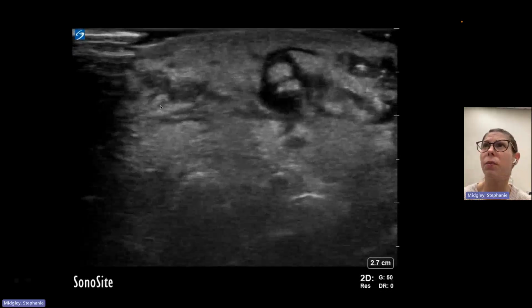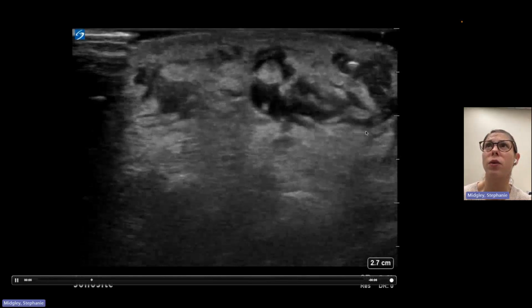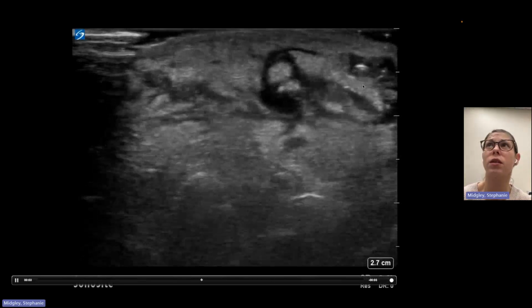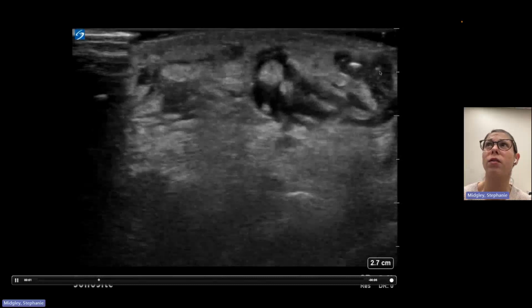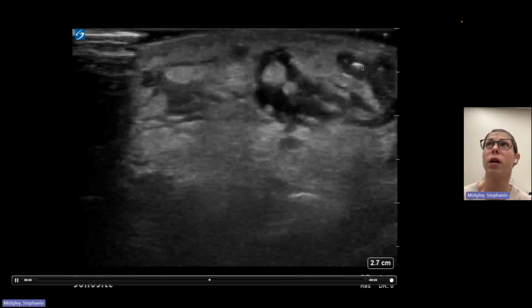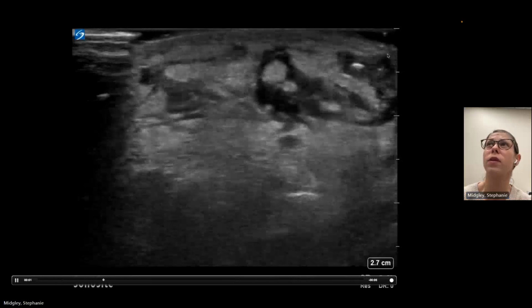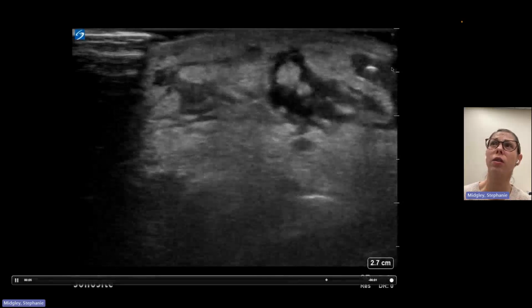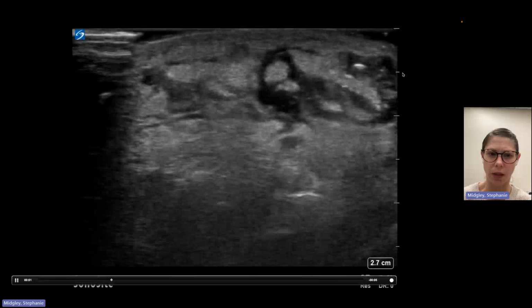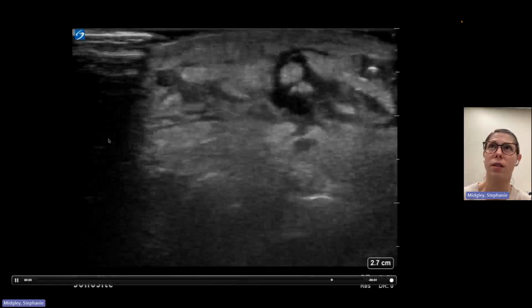Again, here's another example, also taken from image review. This was a patient also with an abscess on his foot. And when they were scanning, if your eye happens to pick up right there, we can see that bright white with a little bit of shadowing there. So there's some free air here. This white line that pops in right here, that's just not making contact with the skin. Same thing here. This is just not skin contact.